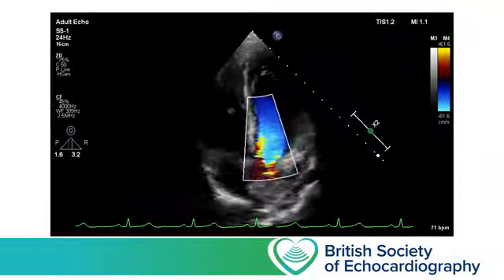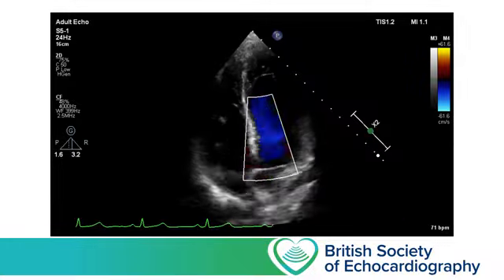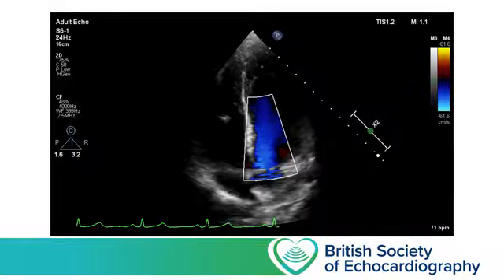Alright, so let's freeze our image at end diastole and then let's advance frame by frame, watching the blood as it travels from the left ventricle down into the left ventricular outflow tract and passes through the open aortic valve. So this is blood that's moving away from the probe, and so relative to the probe it has a negative velocity, a negative frequency shift. And so we'd like the ultrasound machine to demonstrate this blood flow using the blue part of the colour spectrum.